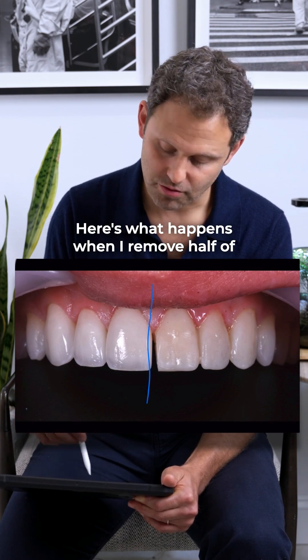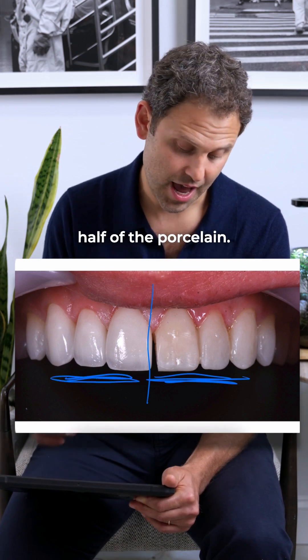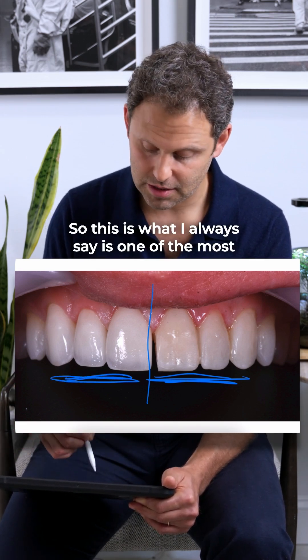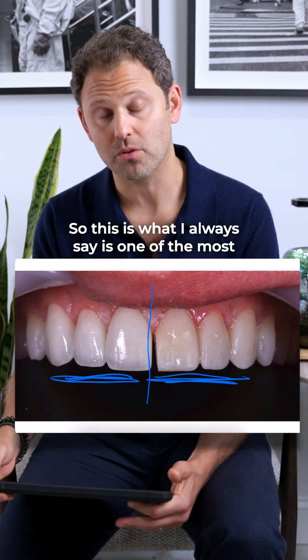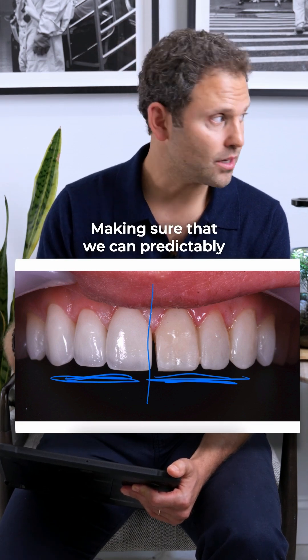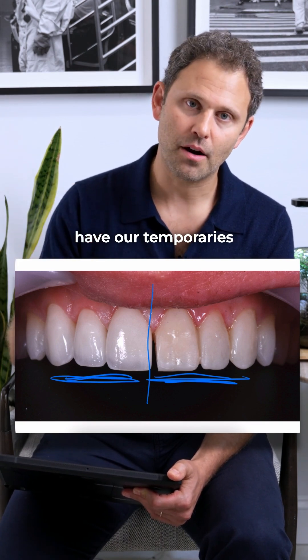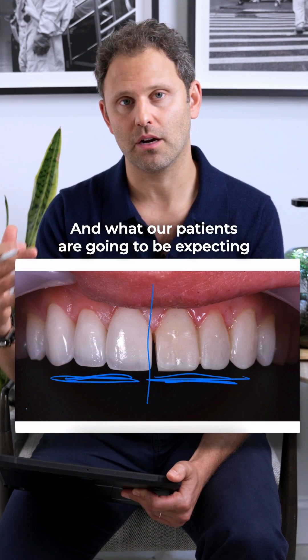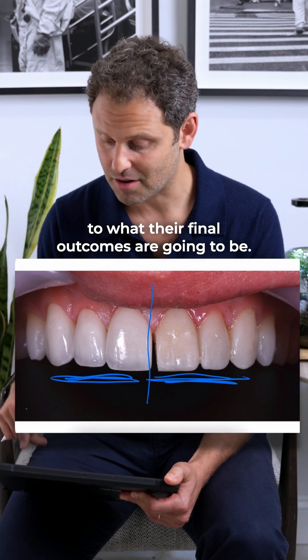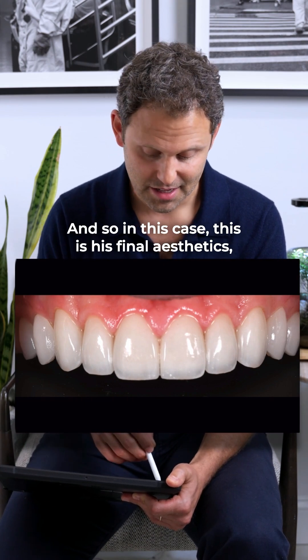Here's what happens when I remove half of my temporaries on one side and match it to half of the final porcelain. This is always one of the most challenging components of a smile makeover: predictability — making sure that what the patient experienced in temporaries matches the final outcome. In this case, these are his final aesthetics.